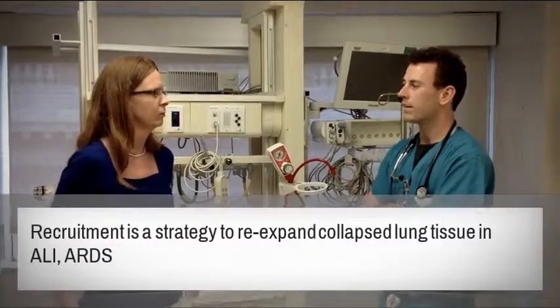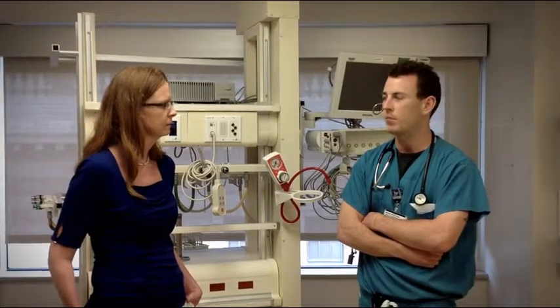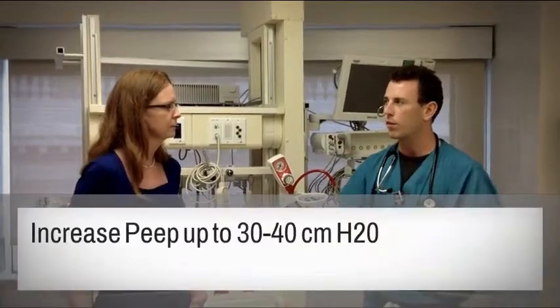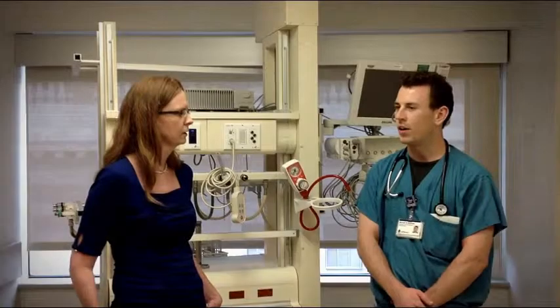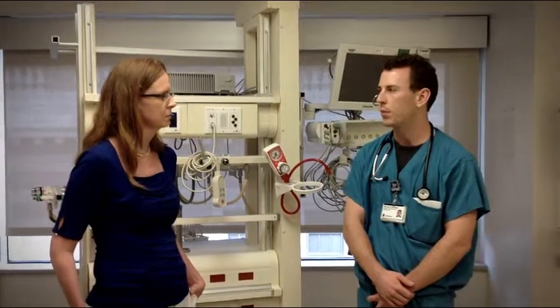So I've heard about a recruitment maneuver. What does that mean? Recruitment maneuver is a maneuver that we do on the ventilator. Pretty much if someone has a lot of atelectasis, which is collapse of certain areas of the lungs, we can give them a high amount of PEEP for a brief period of time to help open up those airways and keep them distended. Why don't we just do a constant recruitment? Constant recruitment could cause barotrauma, volume trauma to the patient. Recruitment maneuvers have that risk, but the benefits usually outweigh the risks.